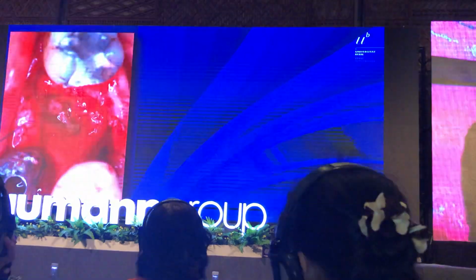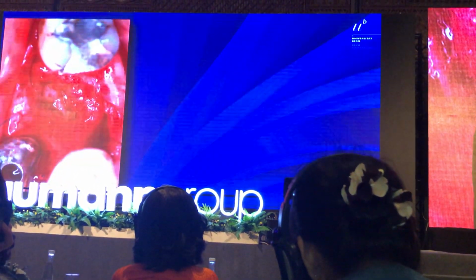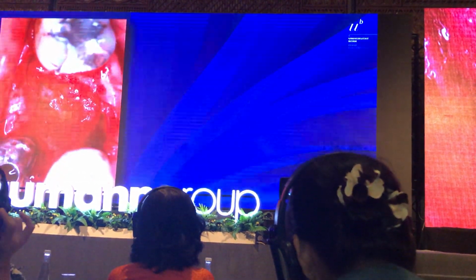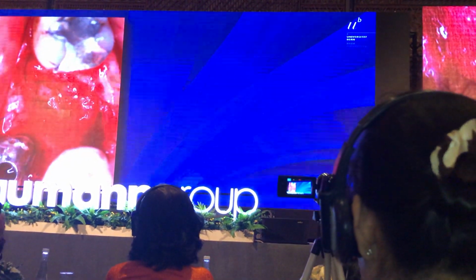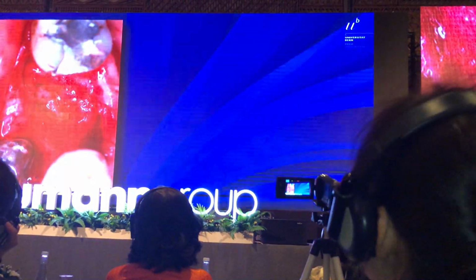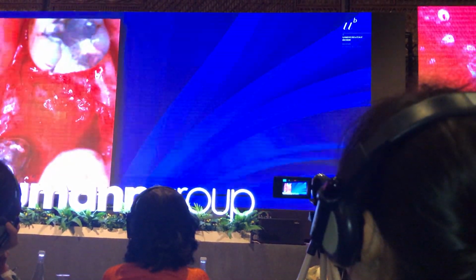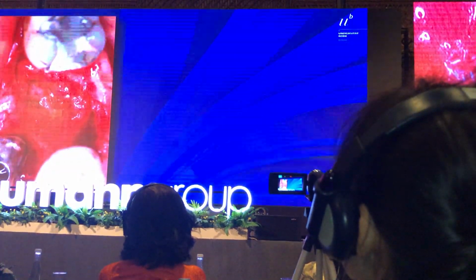And when we open it up, you see, we still have this remaining defect. So that's the defect we had. So, big diamond drill, smoothen it, very important.